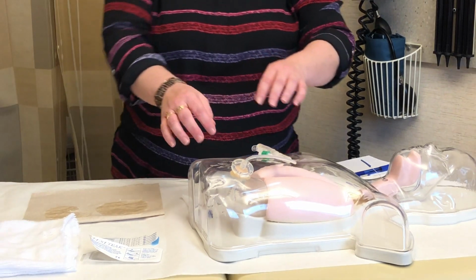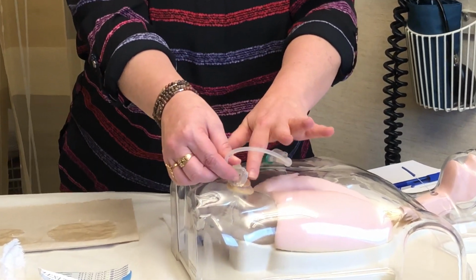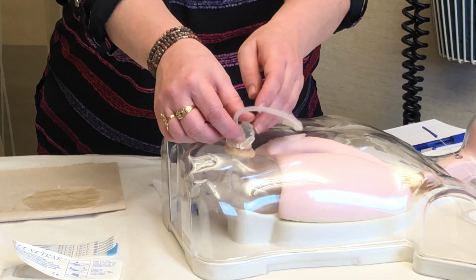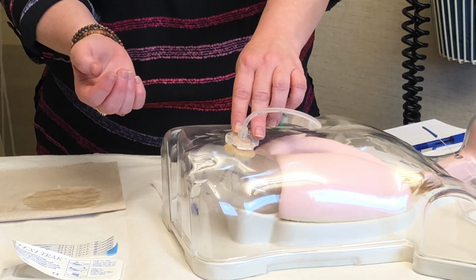While you're doing that, you want to be looking for any redness underneath this skin disc. You also want to be feeling around. Do you have any induration or swelling? Do you have any drainage? Do you have any bleeding? Anything like that you might want to note down.